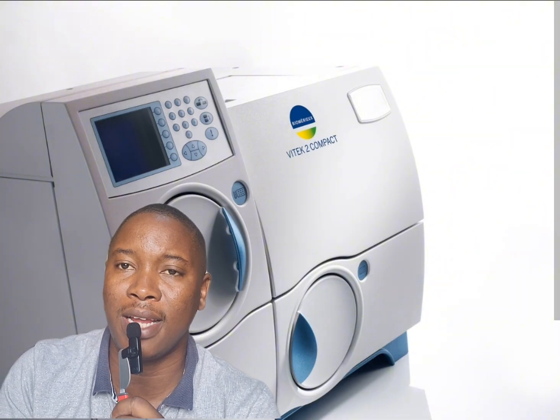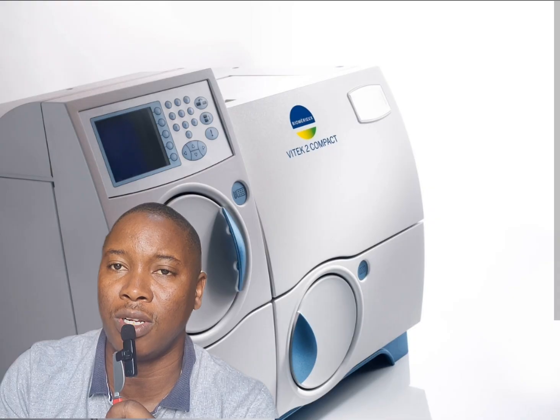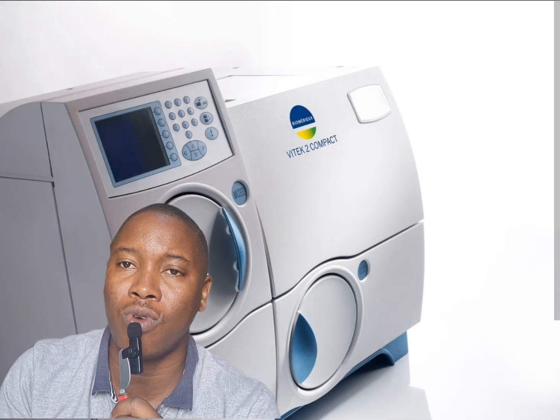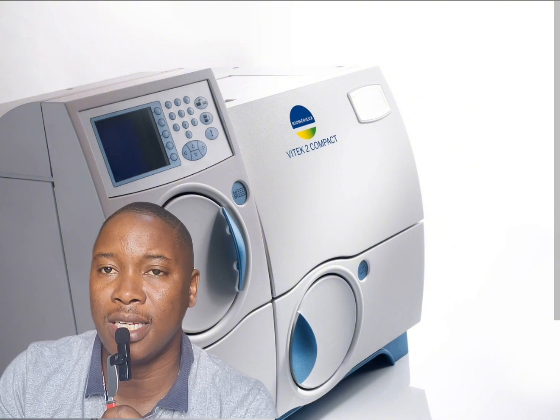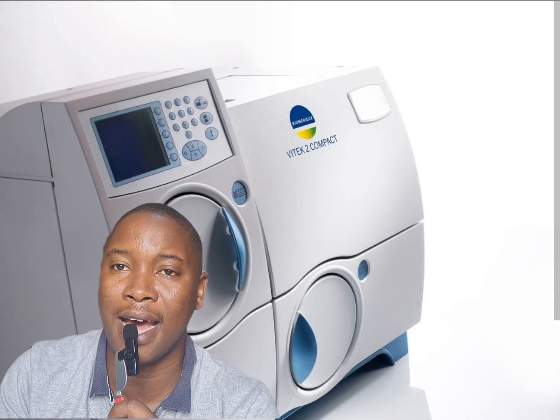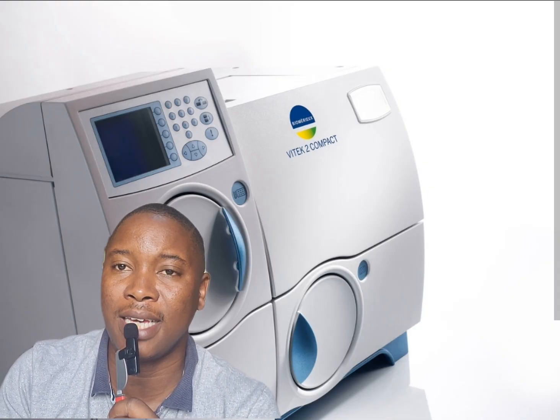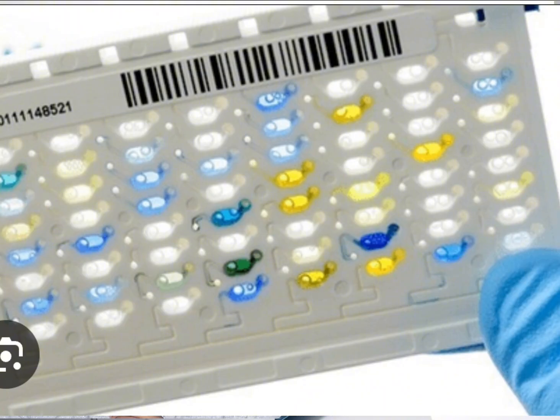Now, it's important to know that this Vitek 2 machine serves two functions majorly. It helps for microbial identification. It can also help to run antibiotic sensitivity tests, ASTs. Now, it's important to note that the machine also has an AST card. The way it has an ID card, which is for identification, it has an AST card, and the AST card is for antimicrobial susceptibility or sensitivity test.